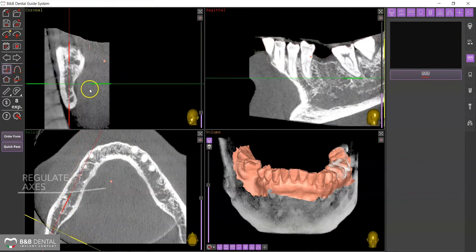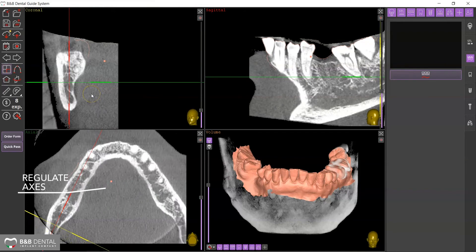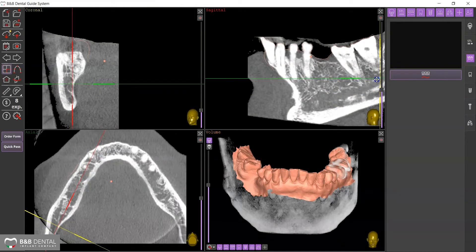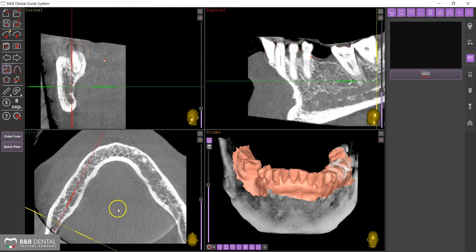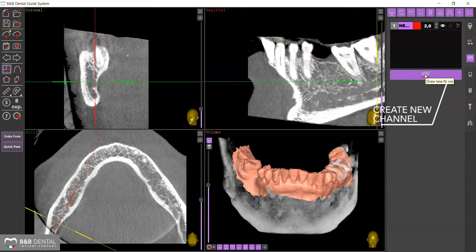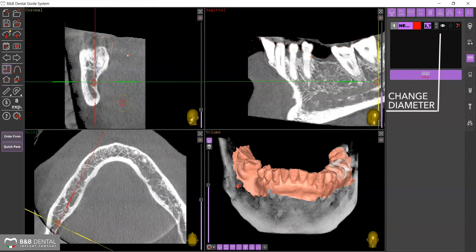Adjust the axes in the axial box to provide a display along the direction of the nerve itself. Once you have found the correct placement, click on the Add Nerve icon and adjust the size of the canal section if necessary.